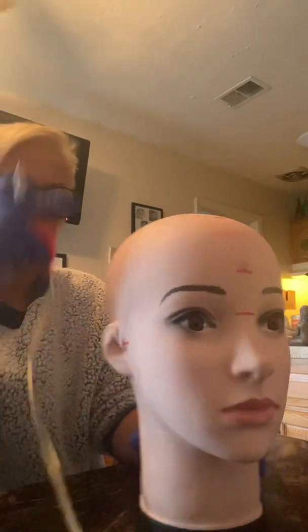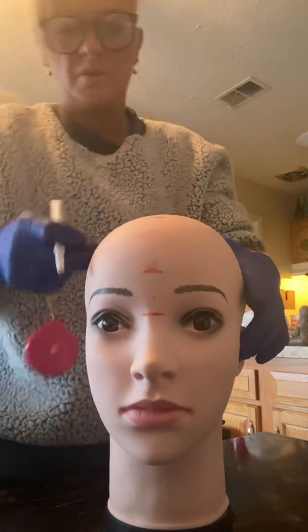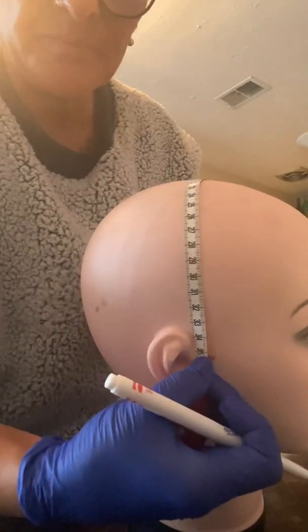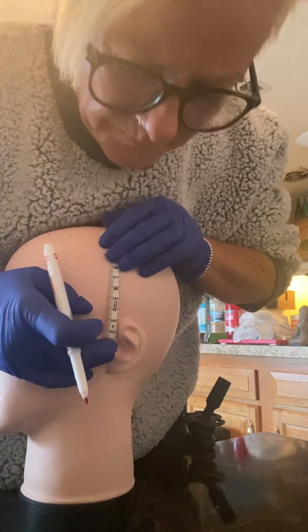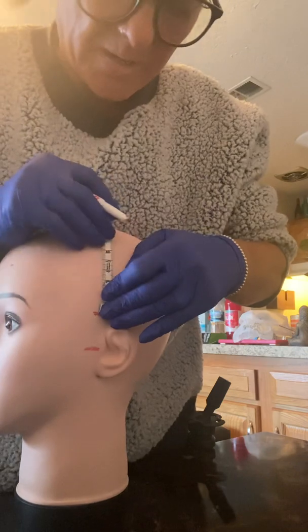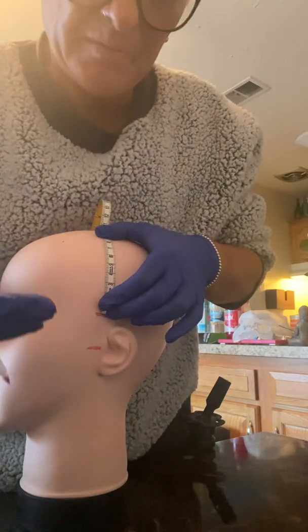Now we're going to measure from preauricular to preauricular. We're going to run the tape measure across the head through the CZ mark, from the first preauricular to the second preauricular, and I'm getting 35. So 10% of 35 is 3.5. You're going to go up 3.5 from the left preauricular, and that's your first mark for T3. Then 20% of 35 is 3.5 plus 3.5, which is 7.